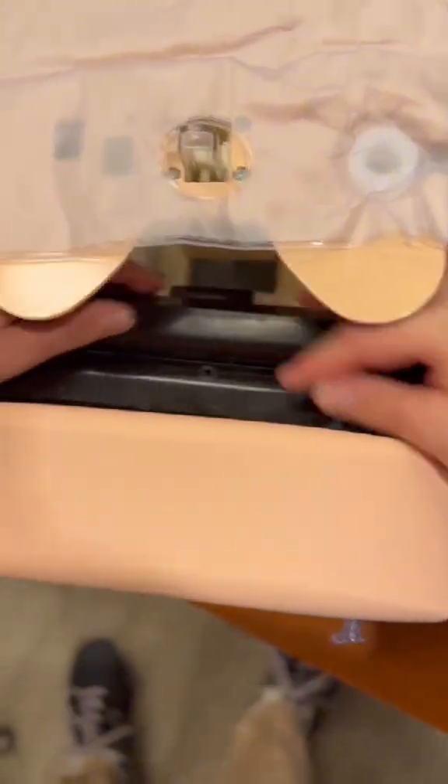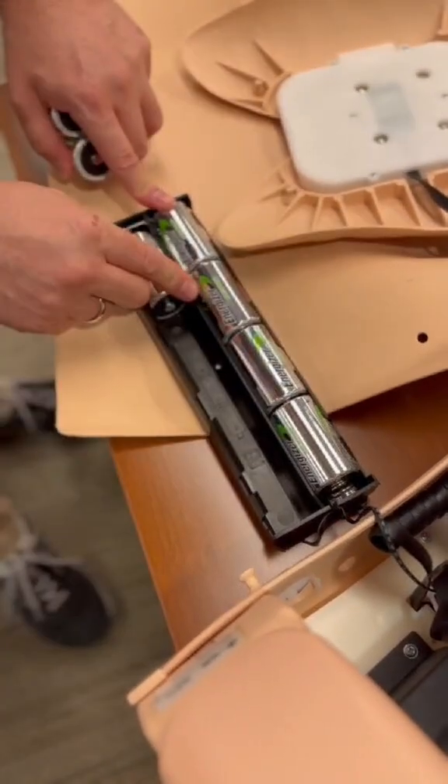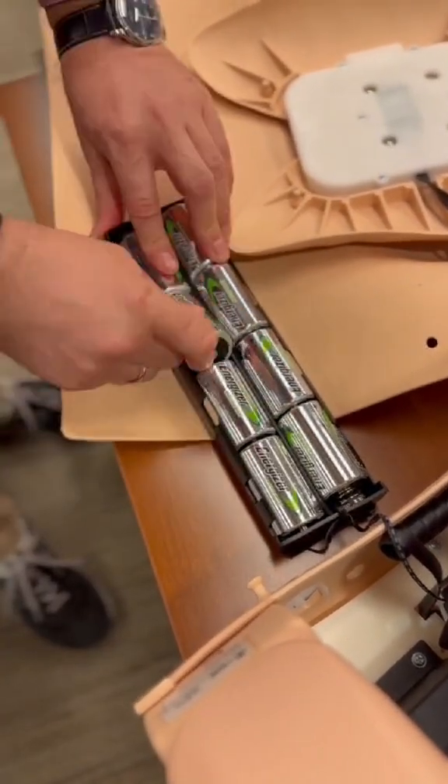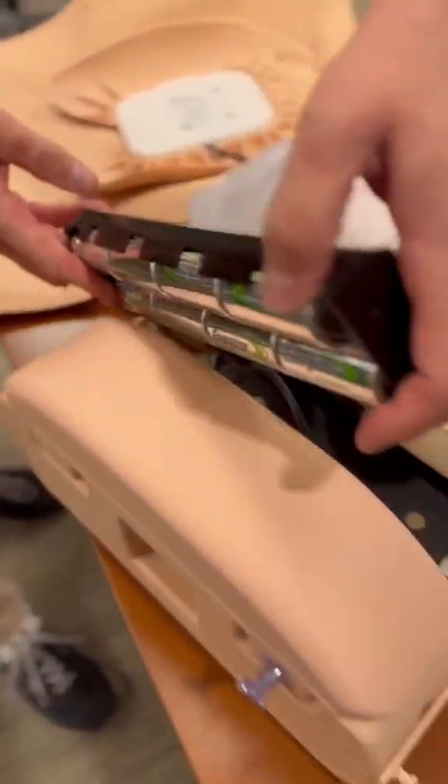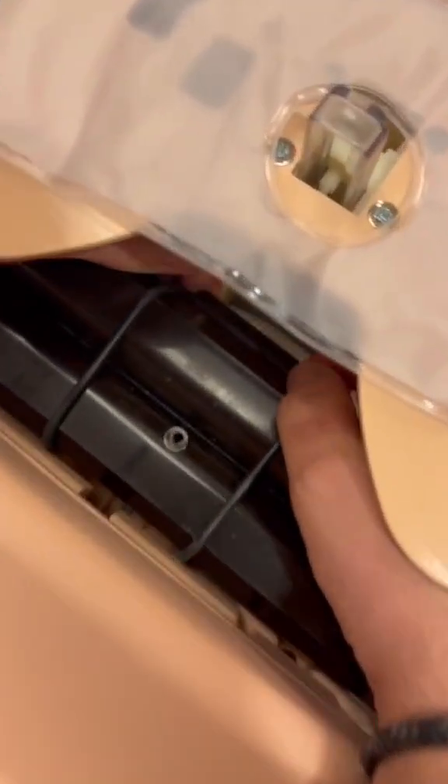The batteries then. Remove the band. Pop the battery compartment out. There on the base. These are quite delicate, so always replace the band.